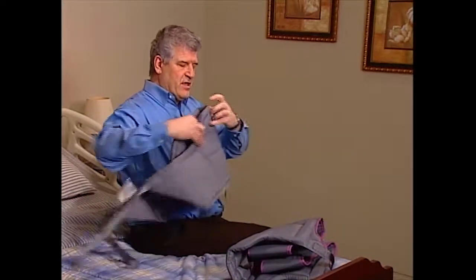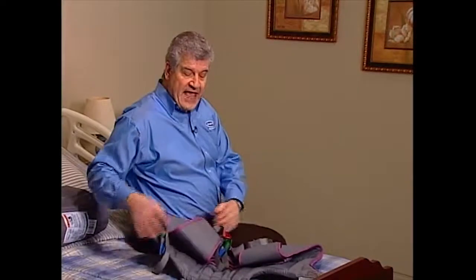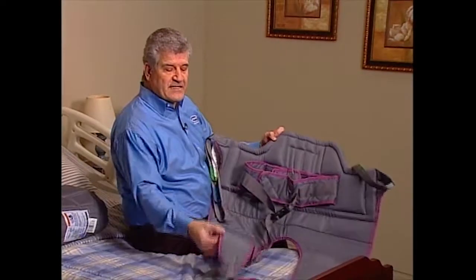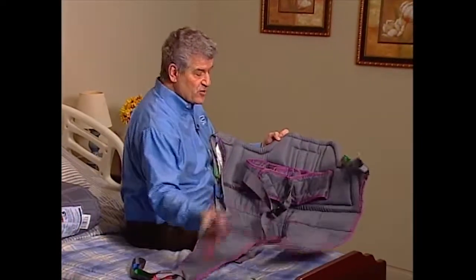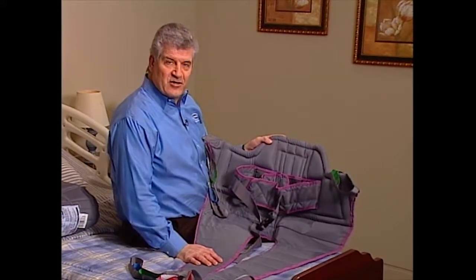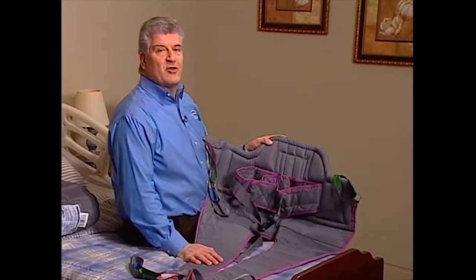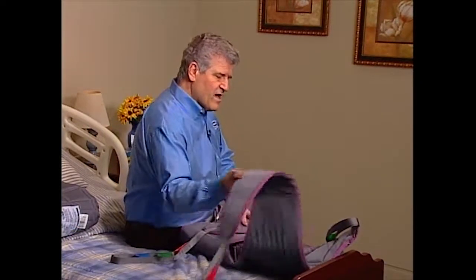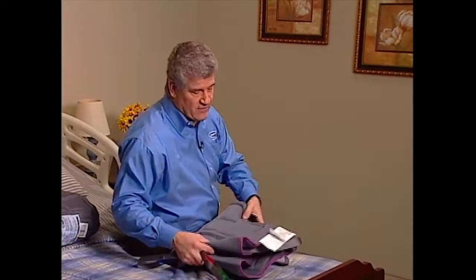Transfer slings are for residents who have neck and head control and can support at least a minimal amount of their own weight. They hook under the resident's legs and support the torso. When selecting a sling, be sure to consider the resident's weight and their ability to bear weight. Always check with a physician before selecting a sling.